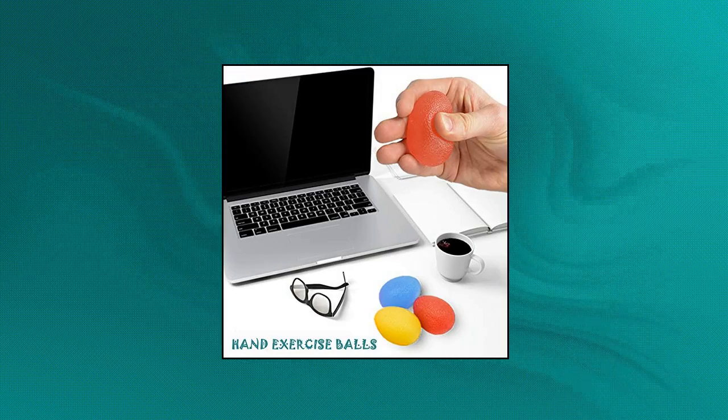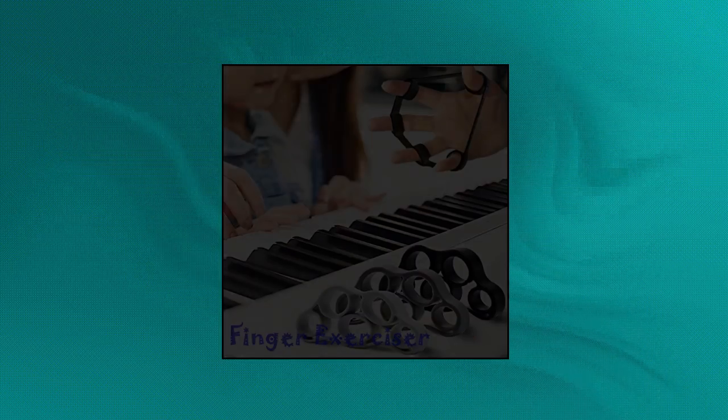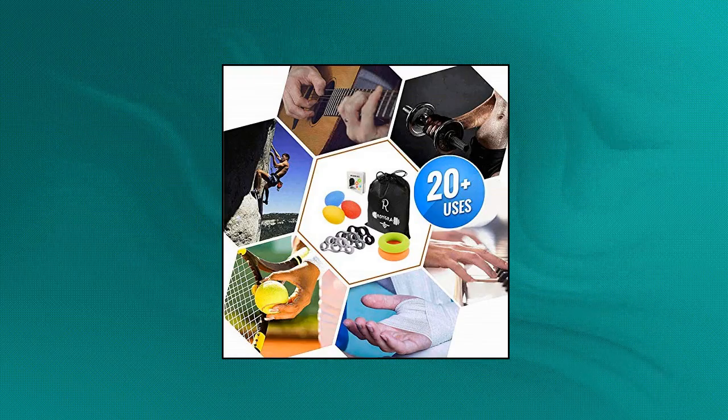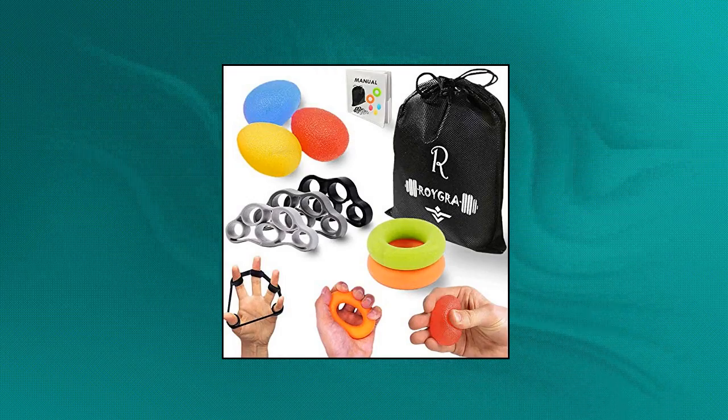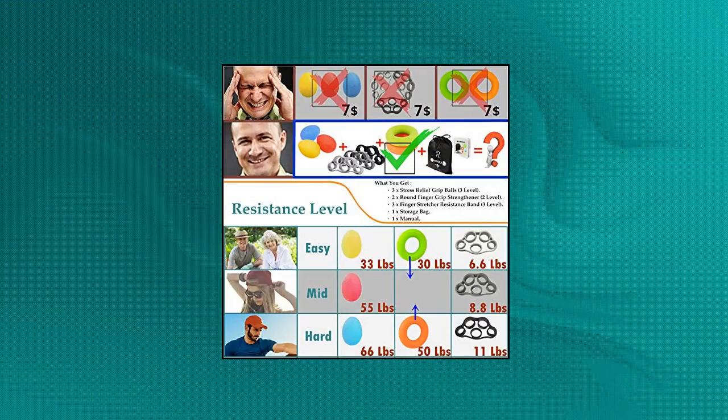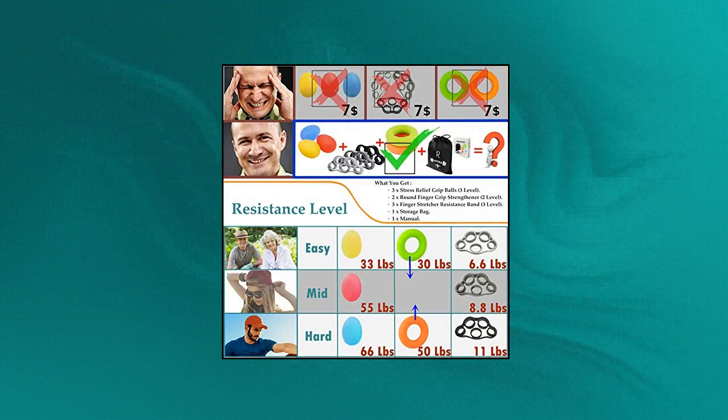Roigra hand exerciser — ergonomic design for all hands. Roigra hand and finger stretchers are designed with everyone in mind. Its ergonomic design is suitable for all ages and hand sizes. It's perfect for men, women, seniors, teens and children as well. The resistance stretchers are portable and lightweight so you can take them along wherever you go.